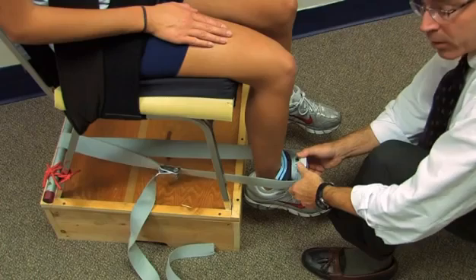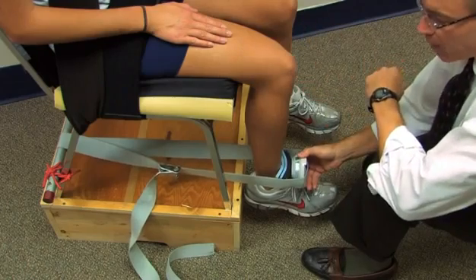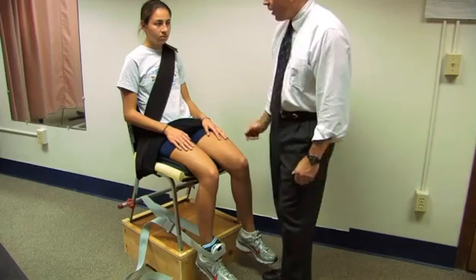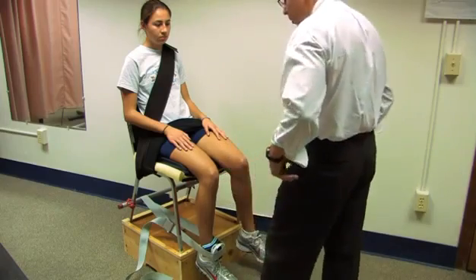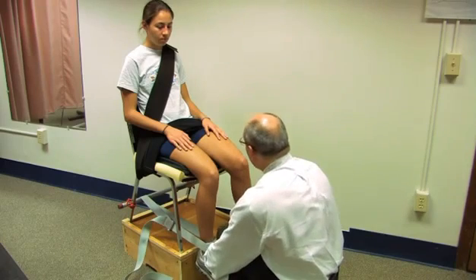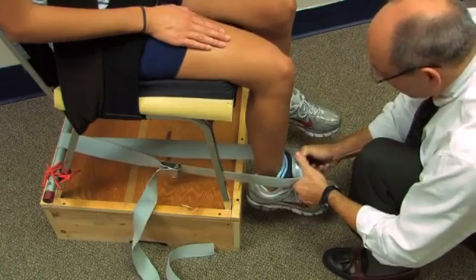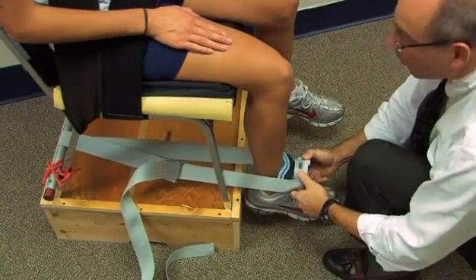Now we're using the handheld dynamometer in a specific way called belt-resisted testing. The point is that the quadriceps are so strong that sometimes the person holding the dynamometer has insufficient strength to hold against the effort of the person being tested. Notice the straps used for stabilization — she's on cushions in the chair and the straps hold her down so we can get an accurate full measurement. The device is placed proximal to the malleoli again. Go ahead — harder, harder. And relax. 134.2 pounds.